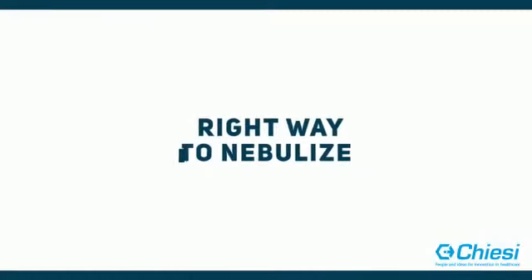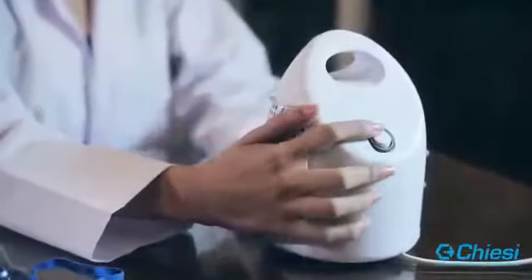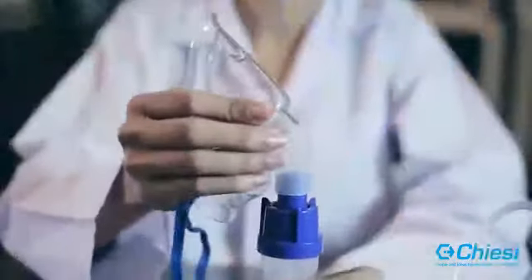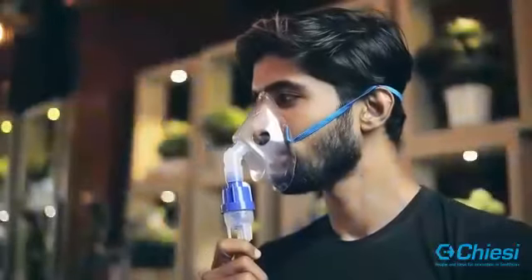The right way to nebulize. Turn the compressor on and check the nebulizer for misting. Put the mouthpiece between your teeth and close your lips around it. Ensure deep breathing throughout the treatment. This allows the medication time to deposit in the airway. Or fix the mask.